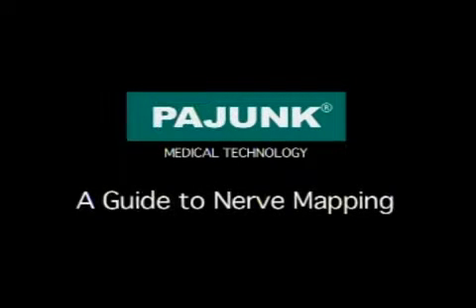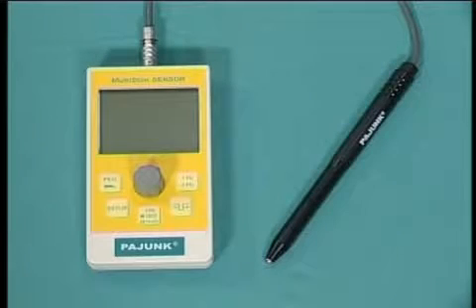The following CD demonstrates the concept of nerve mapping using the PAJUNK nerve stimulator. Anaesthetists will demonstrate the location of the peripheral nerves commonly blocked in regional anaesthesia. The PAJUNK MultiStim sensor consists of a control box and peripheral electrode.